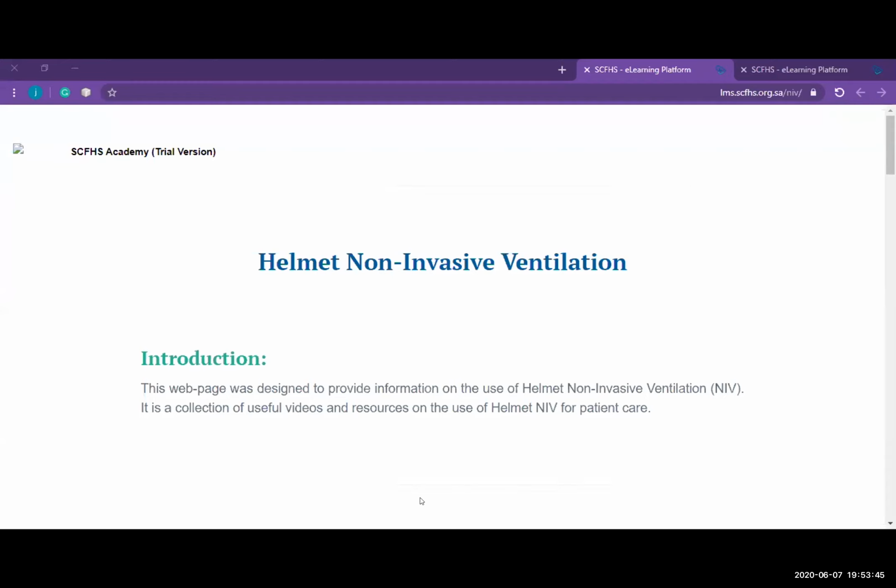Okay, because I'm having a lot of questions about the HME filter. As we said, the whole idea of the HME is that you have to have the inspiratory and expiratory limbs meeting at some point, so you can trap your heat and moisture, which is something we recommend against when ventilating COVID patients, because you want the expiratory limb to be separate from your inspiratory limb to filter the exhaled air as it's leaving the helmet. So at this stage, in the COVID era, we don't recommend using the HME.